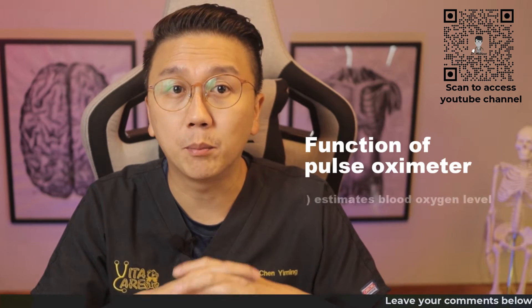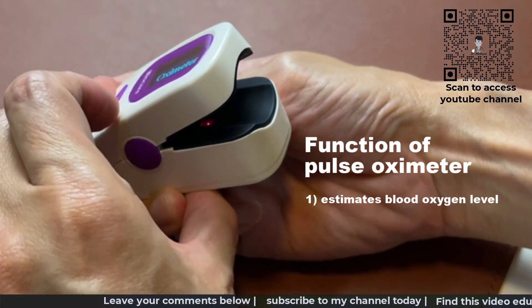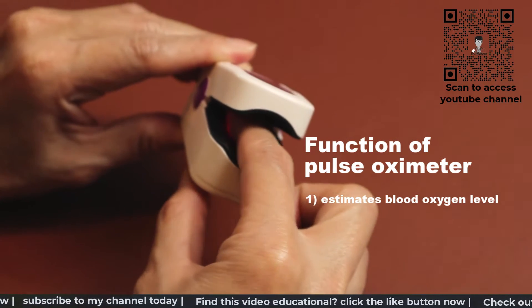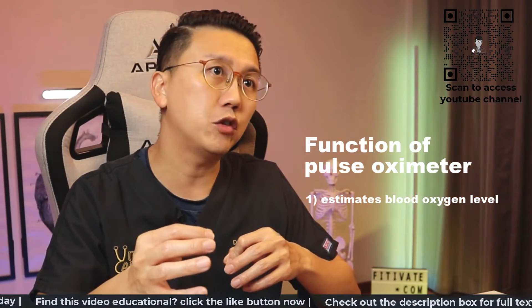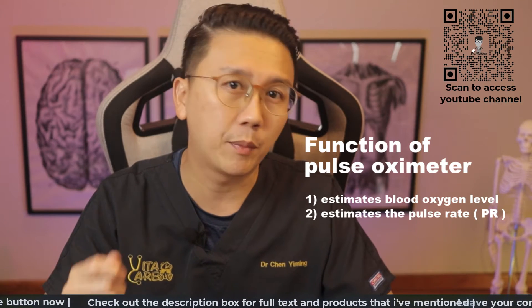The main function of the finger pulse oximeter is to measure the blood oxygen levels in the body. The device works by emitting beams of red and infrared light that pass through your fingertip. Sensors at the other end of the device measure the amount of light absorbed by our blood, and through this process it can estimate the amount of oxygen-carrying hemoglobin in our bloodstream. At the same time, it can measure the number of pulsations within the fingertip and give an approximation of our pulse rate.